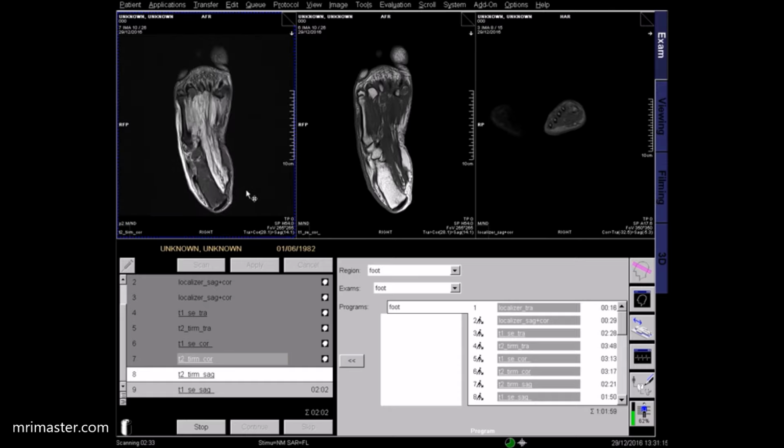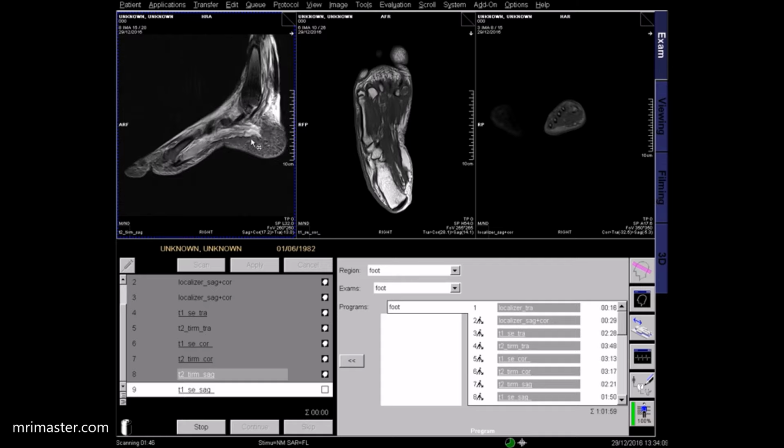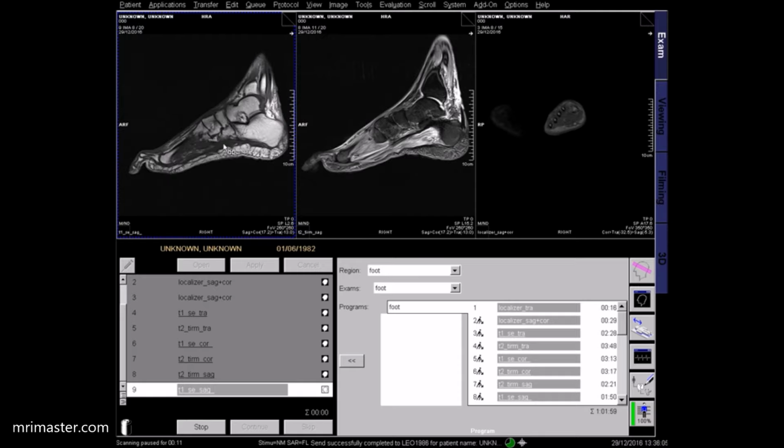In this STIR coronal image, you can see that the fatty bone marrow is suppressed and hence appears dark on the scans. This is a STIR sagittal sequence. Coverage should be from side to side. Here, significant edema is seen as bright signal around the foot. And lastly, this is the sagittal T1 sequence. Again, we need to check image quality and ensure that coverage has been obtained from side to side.